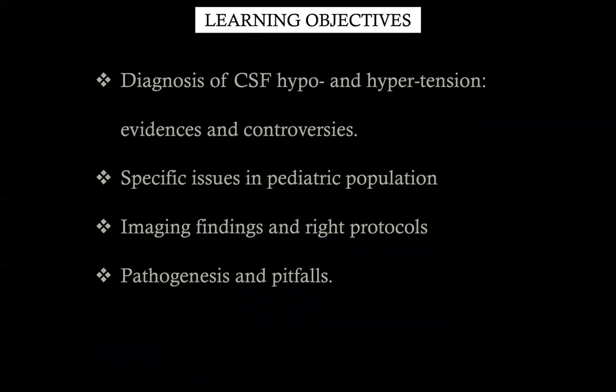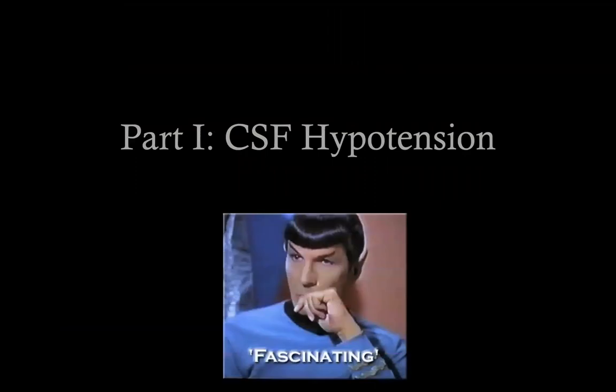And let's start with learning objectives. I will show you how to diagnose CSF hypo- and hypertension. There is evidence, but also controversies. And I will stress the specific issues in the pediatric population. I will also show you some right protocols, pathogenesis, and pitfalls. So let's start with hypotension. That is indeed a fascinating topic.